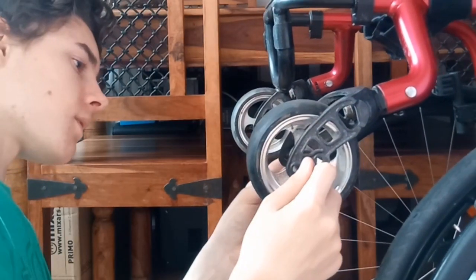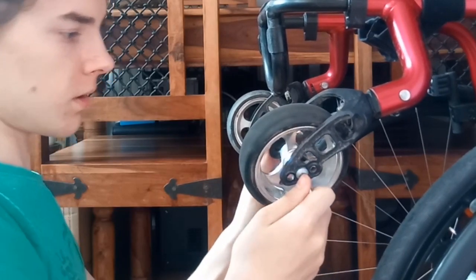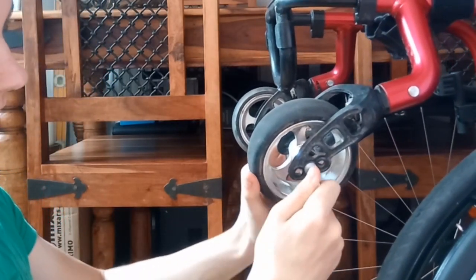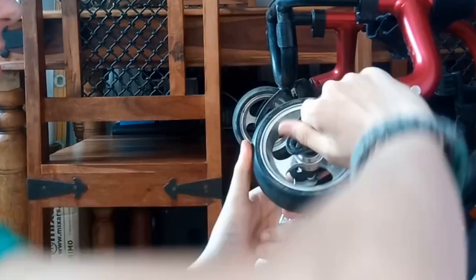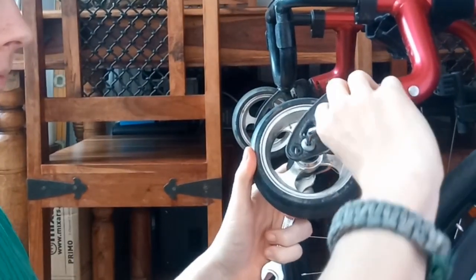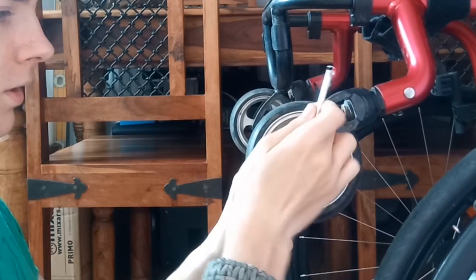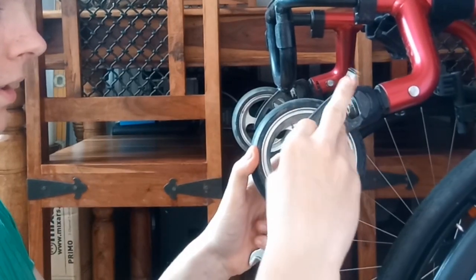Okay, so you get the spanner and you get the screwdriver. Spanner just attaches to the nut, and the Allen key just attaches there, and then you unscrew. It's pretty simple. Assuming you know how to use a fucking Allen key, Jesus Christ.